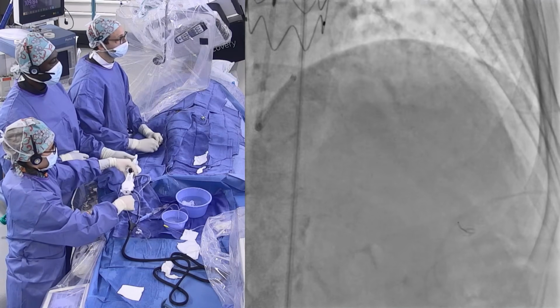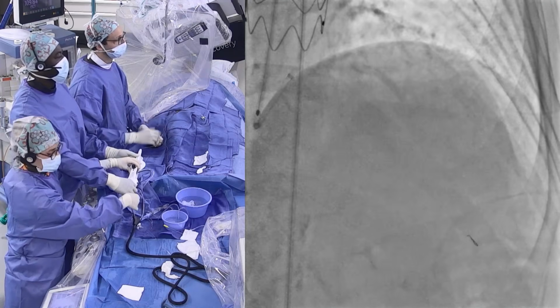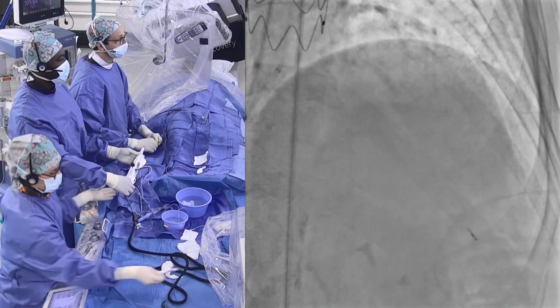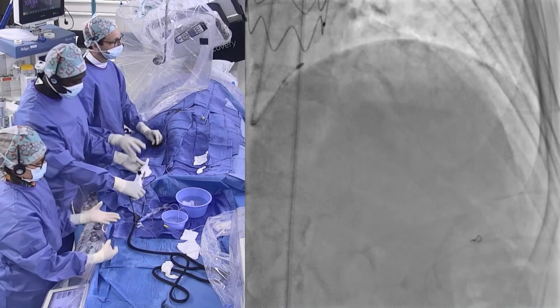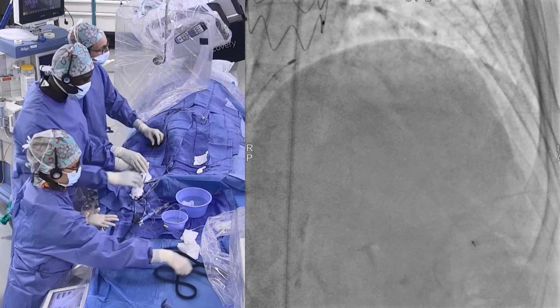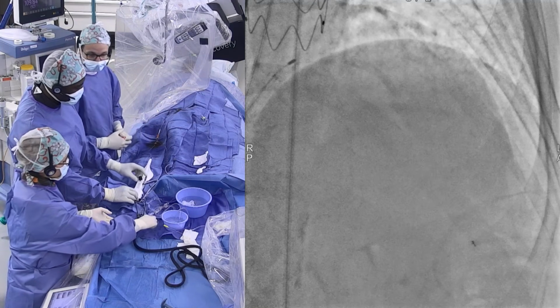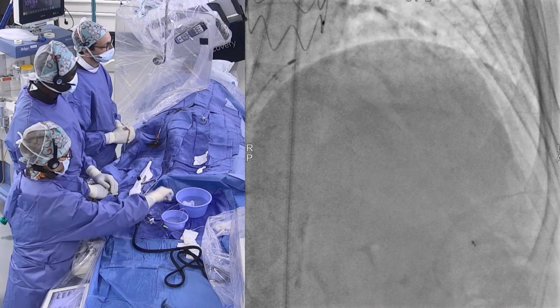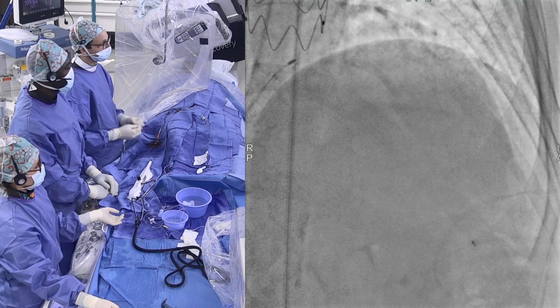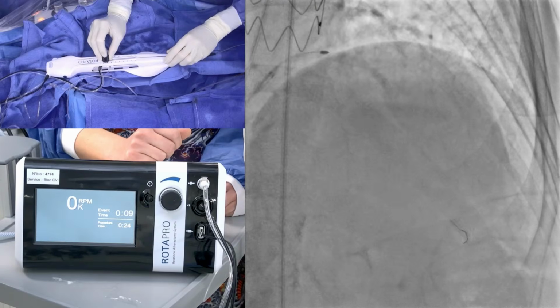But again, there are two kinds of wire with this new RotaDrive: a floppy one, and also a stiff wire. There is an advantage with both. The stiff one is when you want to tackle a longer lesion, but we use a floppy one in this case because there is some tortuosity, to avoid wire bias. But definitely, the risk of kinking is not the same as with the previous one.